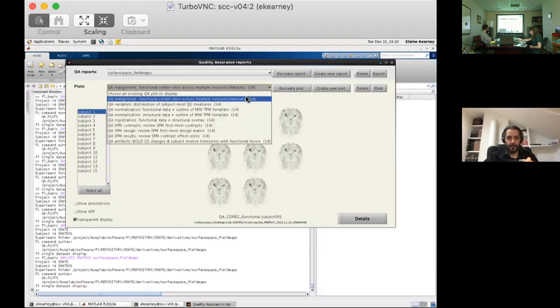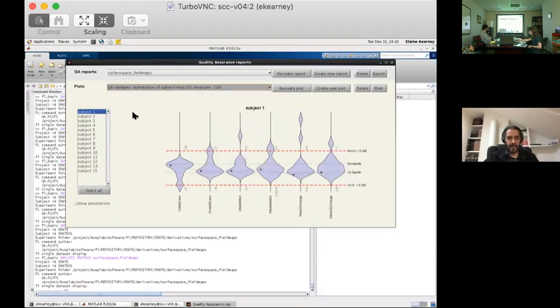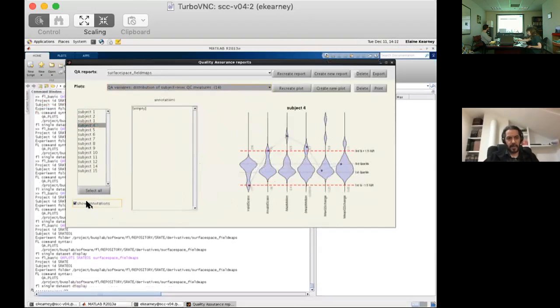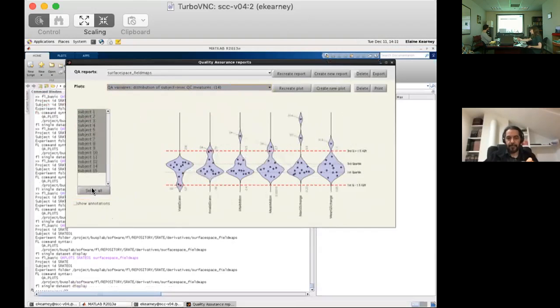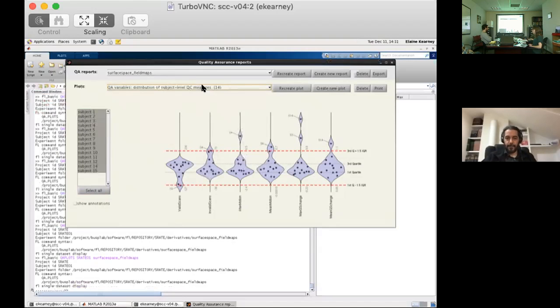So then, I think I mentioned in an email to you that histogram plots. Oh yes, I fixed that. Sorry, that was a bug actually. I fixed that. You should be able to look at those fine now. Oh, perfect. Okay, that's awesome. Should these be the same as in the volume-based analyses? Yes, those are the same.